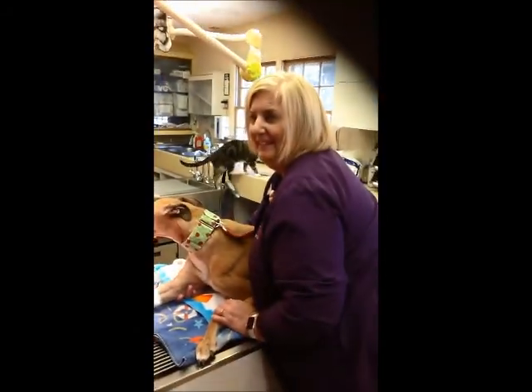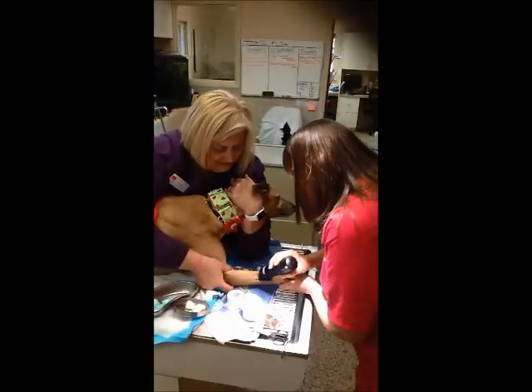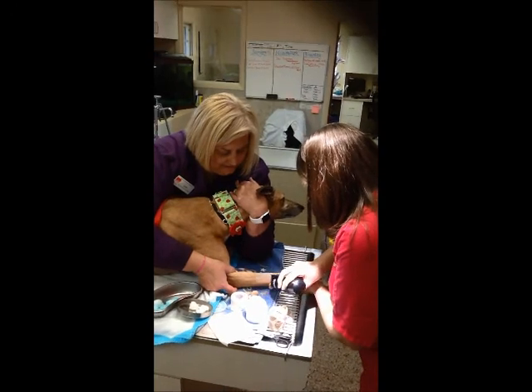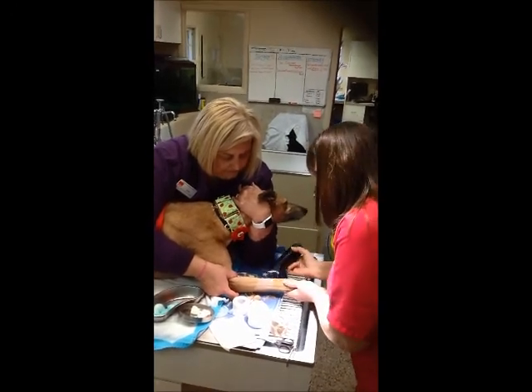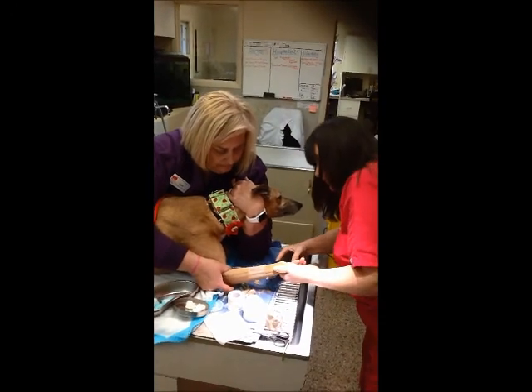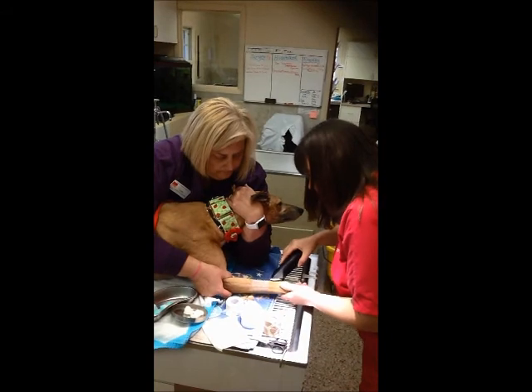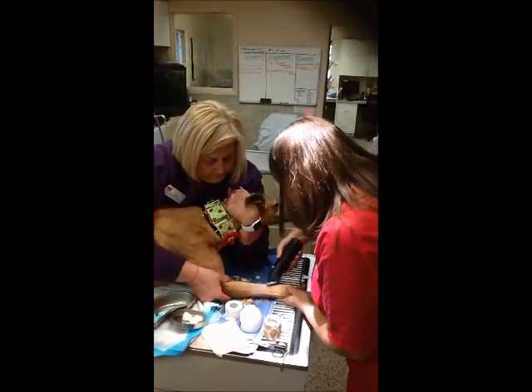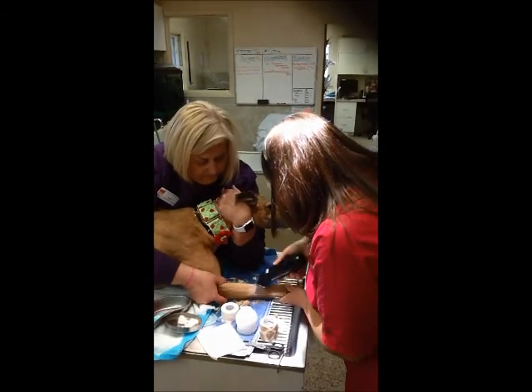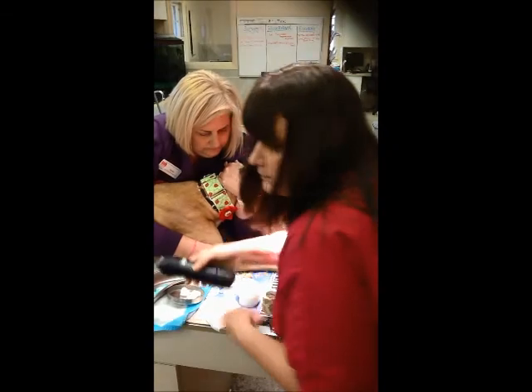And she's getting... Lynn, this is my preceptor. She is my certified veterinary technician and my supervisor. Looking up for a catheter. The rule of thumb is two clipper blades away from the vein. And then put her all the way around. Such a good girl.